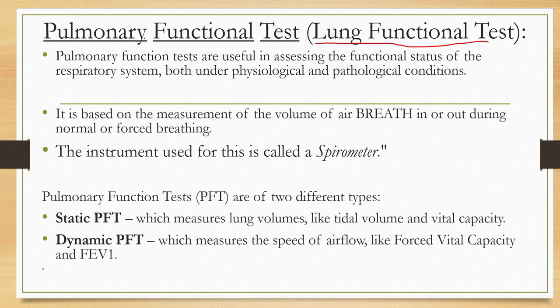Let's see the definition. Pulmonary function tests are useful in assessing the functional status of the respiratory system, both under physiological and pathological conditions. It is based on the measurement of the volume of air breathed in or out during a normal or forced breathing. The instrument used for this is called a spirometer.